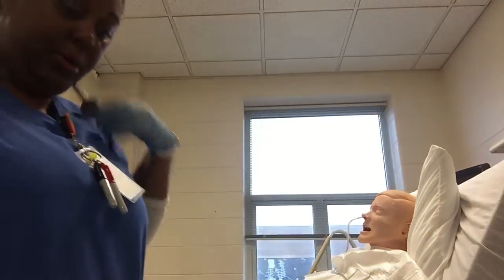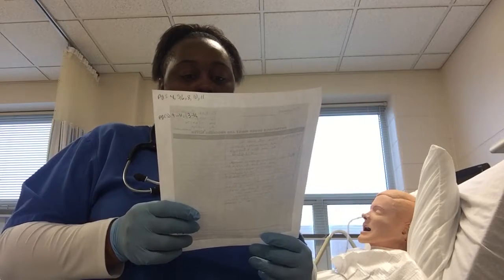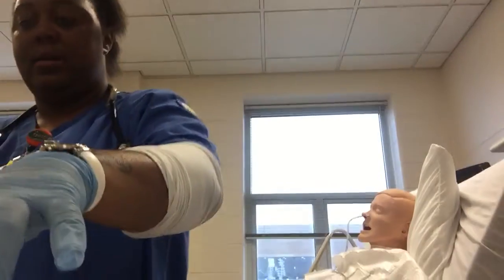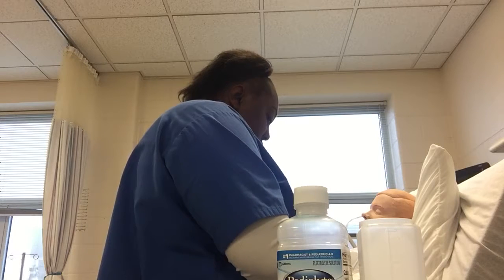Next, the order calls for performing a gastric lavage via NG tube with normal saline until contents are clear. So, already I will have my saline. What I will do first, obviously, I will knock on the door, identify the patient by 2 means, and then I will get the NG tube.